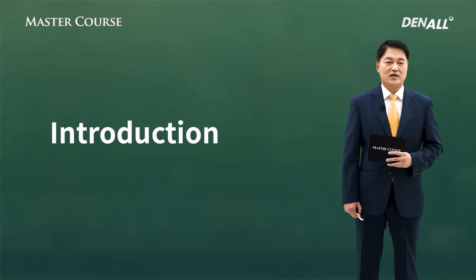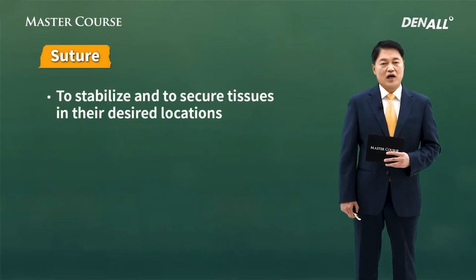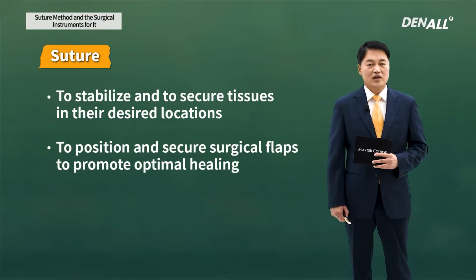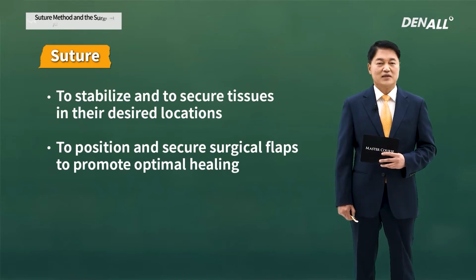So what is suture? It's to stabilize and to secure tissues in their desired locations, and to position and secure surgical flaps to promote optimal healing. These will be the definitions of suture.